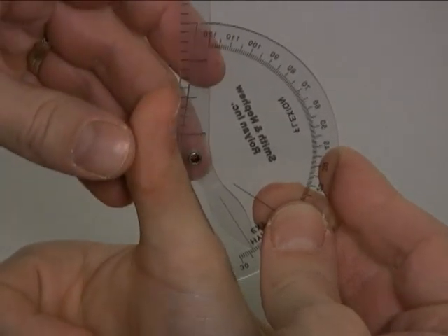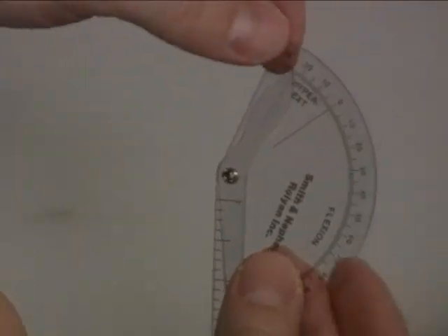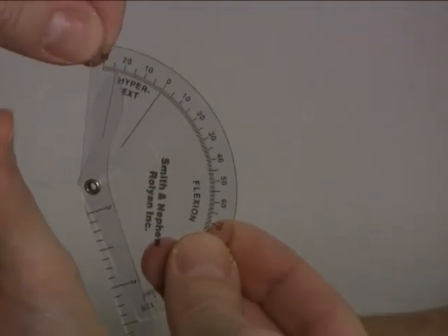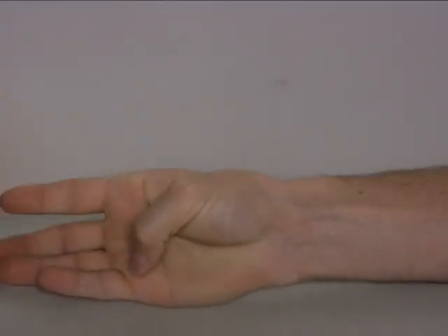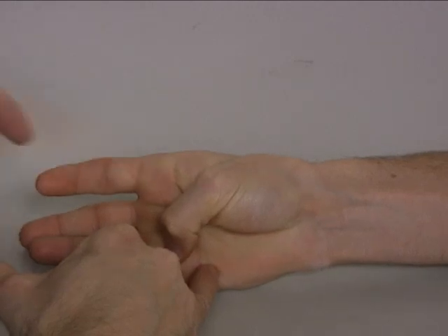Can you get any farther back than that? That's about it. Very good. So we have about 23 degrees of hyperextension at the thumb IP joint. And then can you bring your thumb all the way down? Try to touch way back here. Get it really tight.